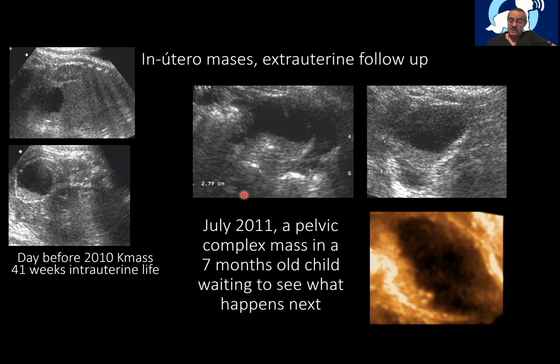Sometimes we can find masses on the adnexa even before birth. Before birth, I saw this. Day before Christmas, 2010, 41 weeks, about to be taken out.